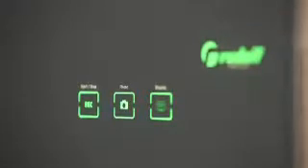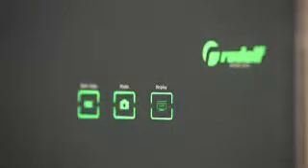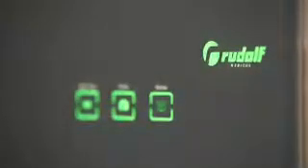Via the Record button, start or end the video recording. Via the Photo button, take individual images. These functions can of course also be operated via the remote control key of the camera head or a connected touchscreen. Via the Display button, you have the option to use a main monitor integrated in the system and pre-configured accordingly as the control monitor for the documentation system.